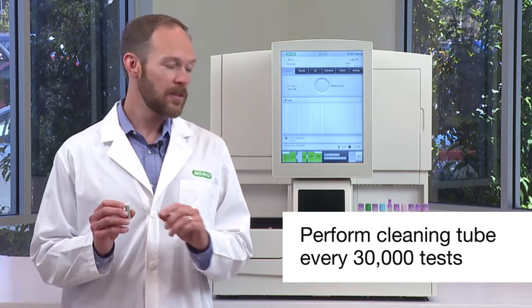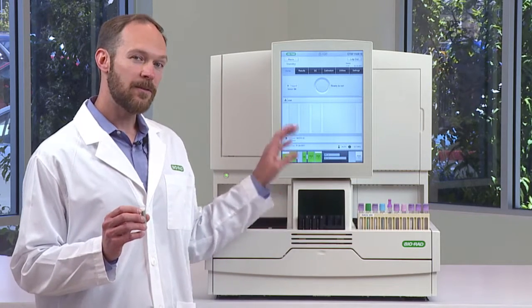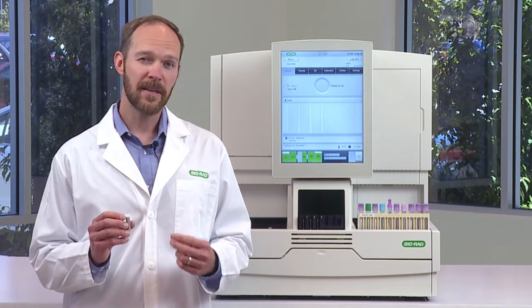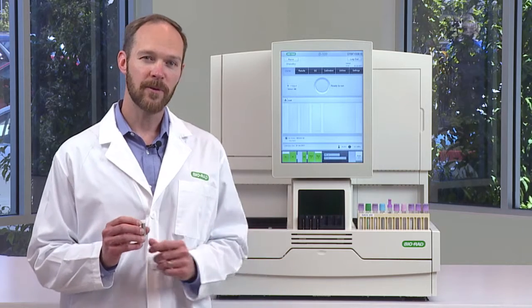To run the cleaning tube, you load it in the stat area and follow the on-screen prompts. The whole process takes about two minutes, and after the cleaning process is done, your system is clean and ready for operation.